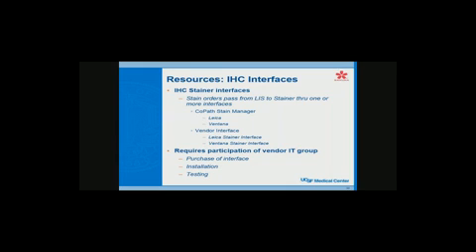We're using Leica Bond stainers for this, and that completely eliminates all the programming that has to go into the stainer. Our turnaround time literally dropped by hours when we started doing this, and it's much more accurate as well. So in this case, a stainer interface has to go from the LIS to the stainer.